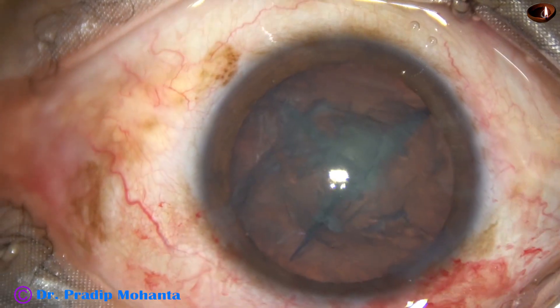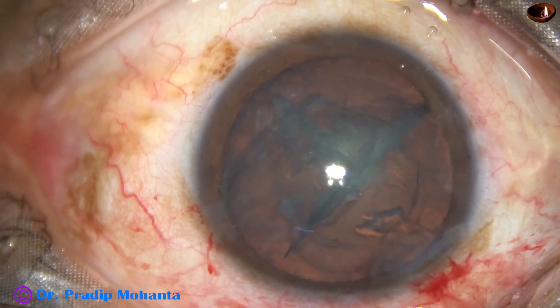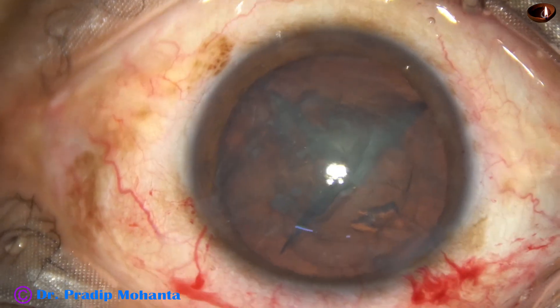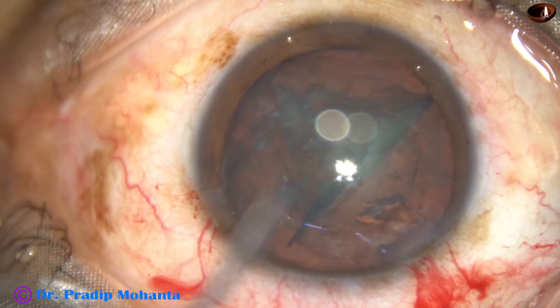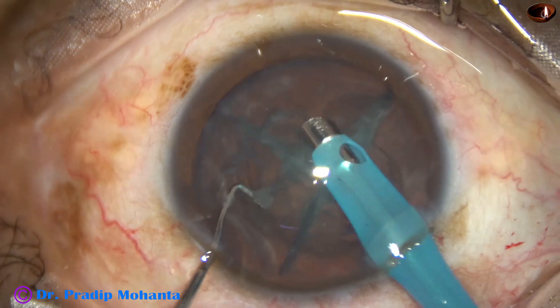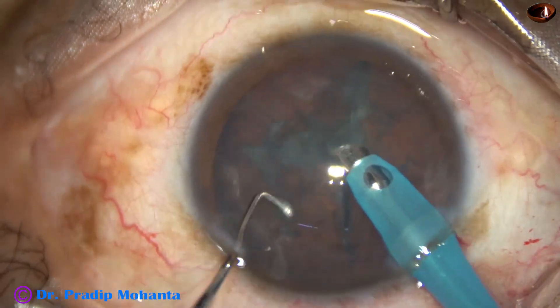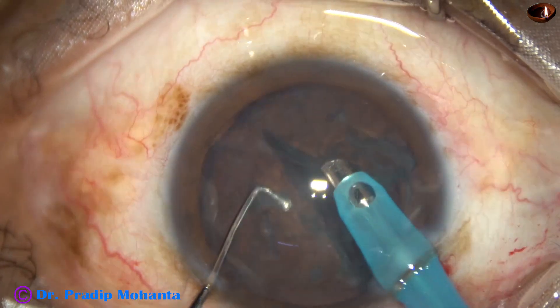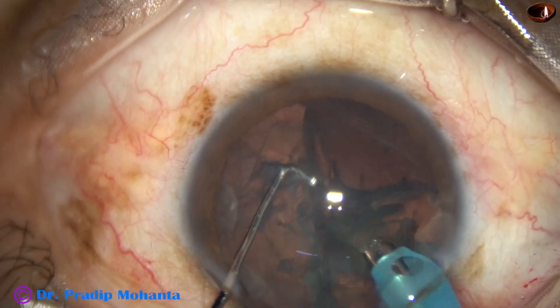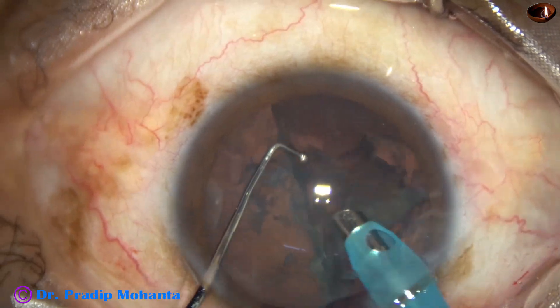One hemi-nucleus has been divided. We have got three pieces on one hemi-nucleus and the other hemi-nucleus has been divided into two pieces. Now is the time to go into the anterior chamber with the handpiece. I rotate the nuclear mass several times, go into the cleft and try to get one piece out of the bag. Though I have divided it, still there is some attachment and it does not want to come.